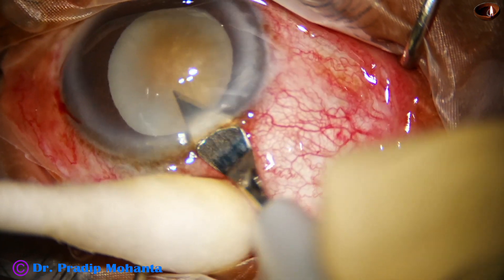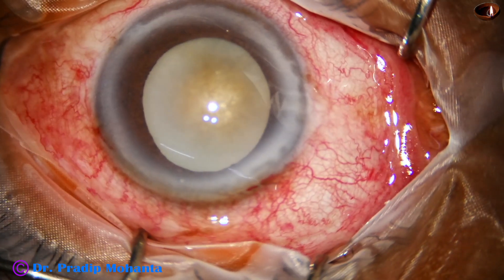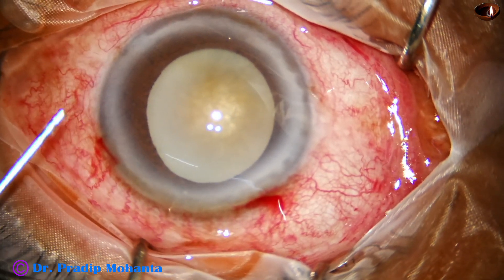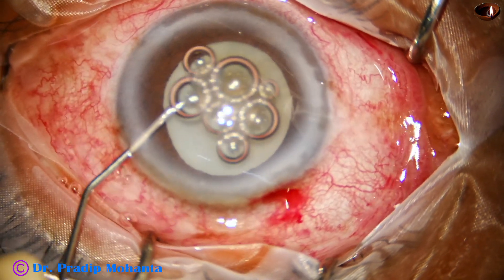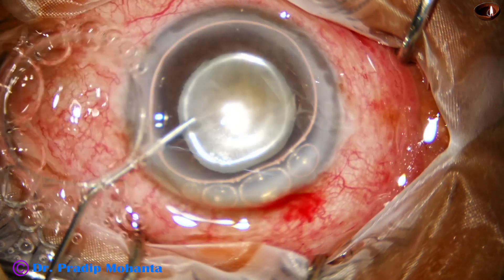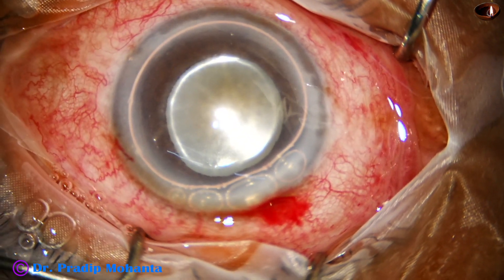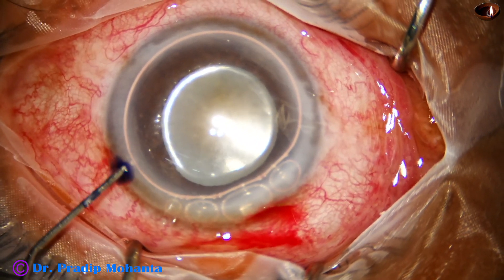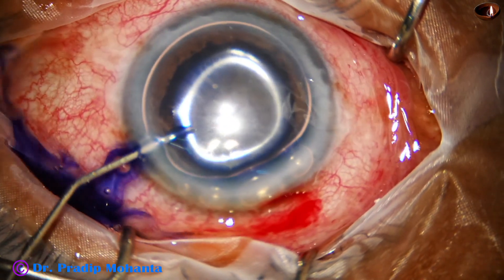A side port has been made, and this is the main incision. Care is taken to go a little on the corneal side so that bleeding can be avoided. There is some circumciliary congestion in this case.